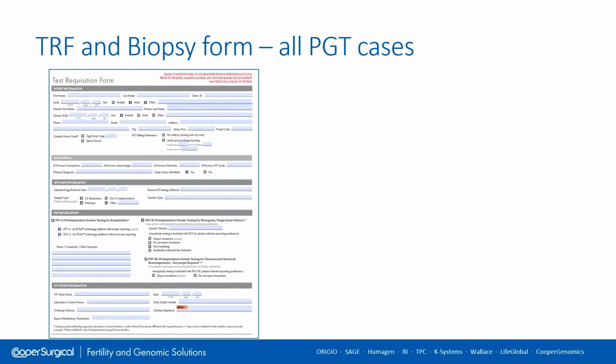We also need to capture very basic information about your IVF center. So where to send the results and who is the contact person at your clinic.